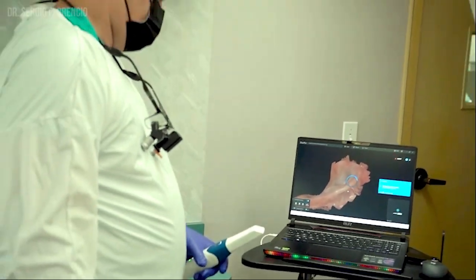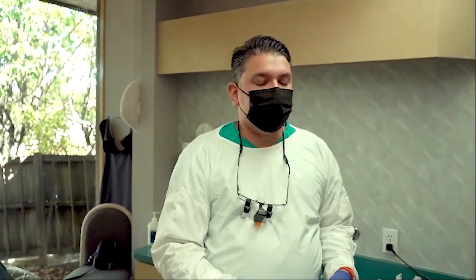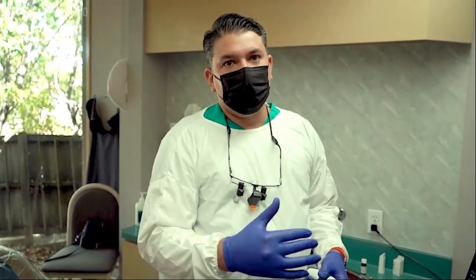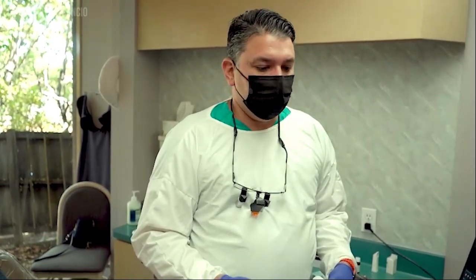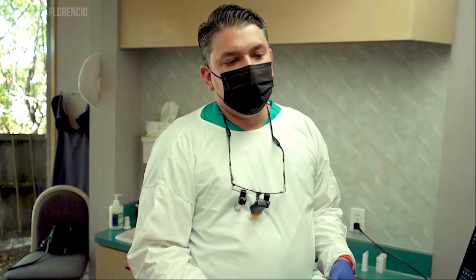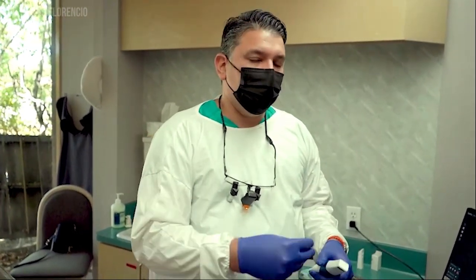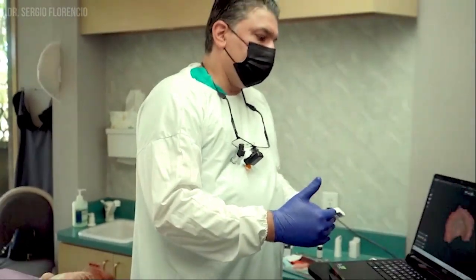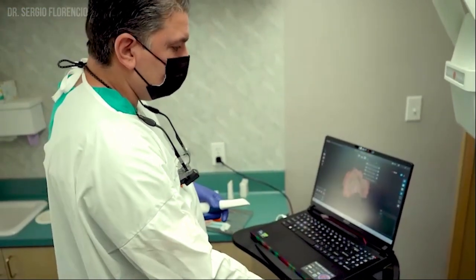The biggest problem with digital dentures using an intraoral scan is that there's no way to border mold the denture. With movable tissues, border molding is important to get proper extension and know how much you can extend the dentures. Digitally, you can pull the vestibule with your hands, but it's never the same as a regular border mold with wax. If you do have a tray, you can border mold it, take an impression, and merge that analog impression with the digital scan — the software can do that. I'm going to add a pre-op scan so we have all the scans together.